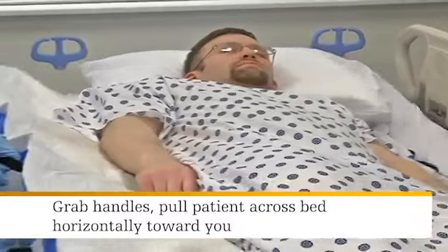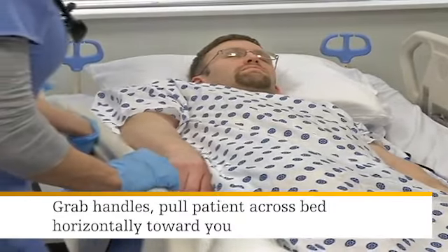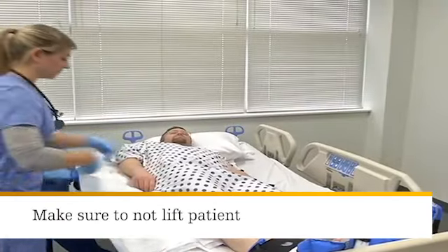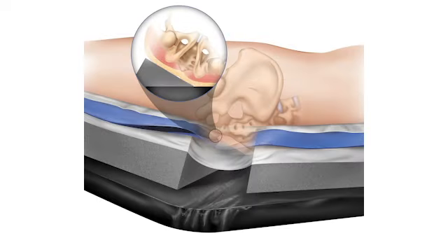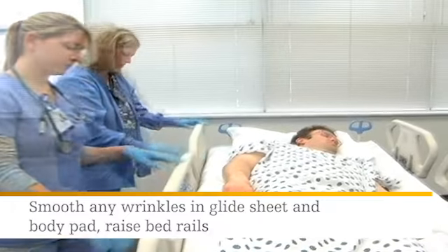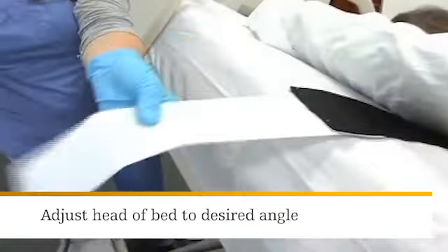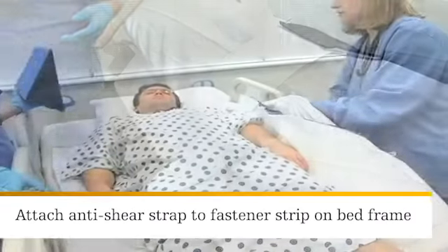Next, grab the black handles on the glide sheet and pull the patient across the bed horizontally toward you until the patient is angled between 20 and 30 degrees. Be sure not to lift the patient — the patient is positioned correctly when the sacrum is offloaded. Smooth out any wrinkles in the glide sheet and body pad, then raise the bed rails. Adjust the head of the bed to the desired angle, and attach the anti-shear strap on the glide sheet to the fastener strip on the bed frame.